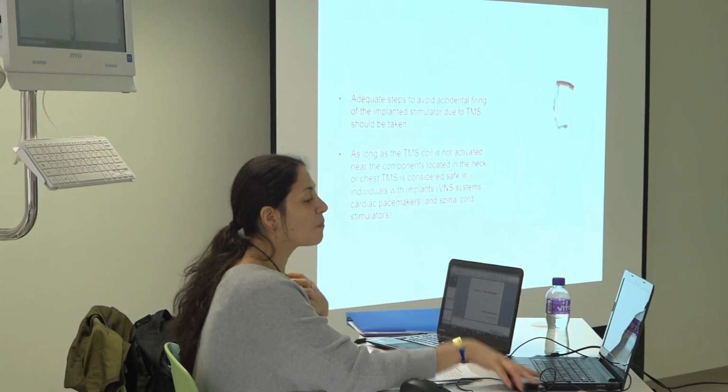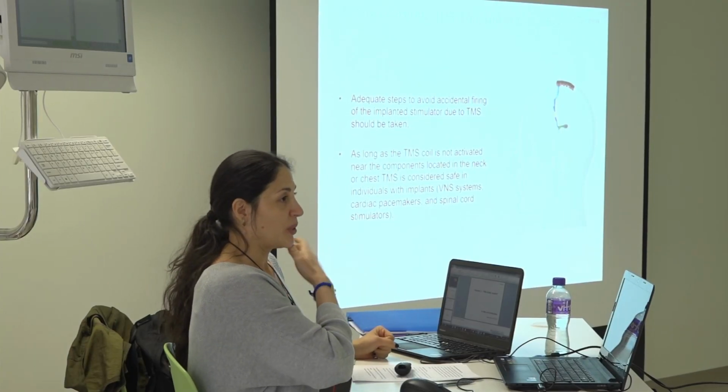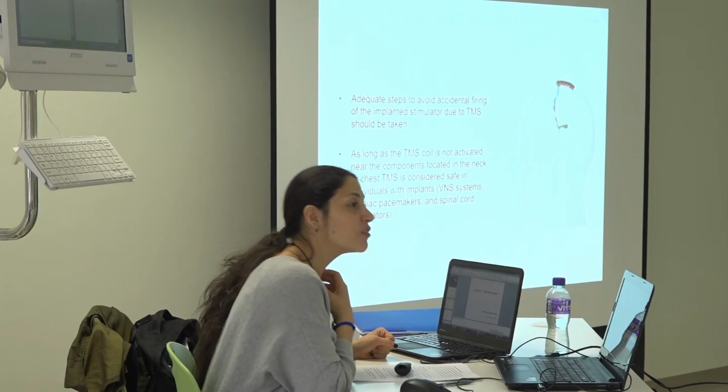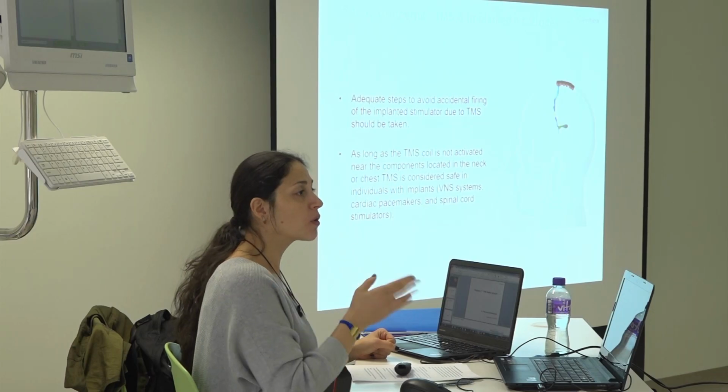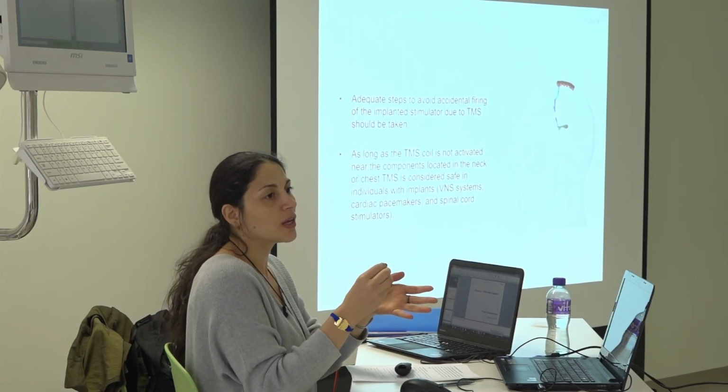For people that have pacemakers and spinal cord stimulators, there is also a question in the TMS questionnaire. As long as it's not applied over the area, it's fine. I wouldn't measure it anyway, unless I have to. But if I don't have to and I'm working with healthy subjects, I will definitely only work with healthy. It means people without any issue, no medication, nothing of any type. Yeah, it's not like he's unhealthy, but definitely is not the normal person walking outside.